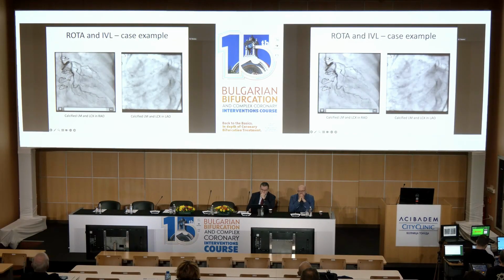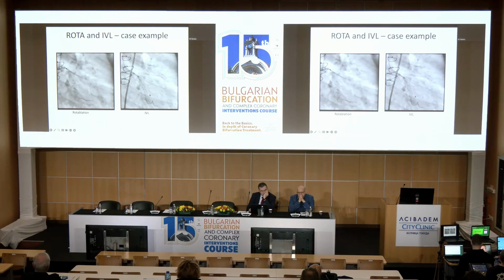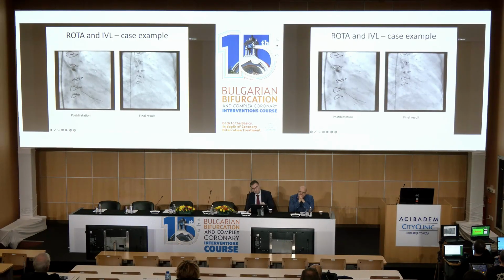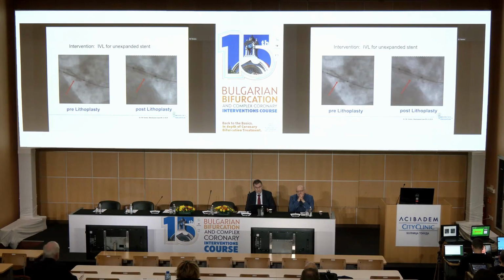This is something for Shockwave, Rotashock. Just make a channel, and then you can finally manage such patients with a method known as Rotashock, very, very elegant. Shockwave is very useful.